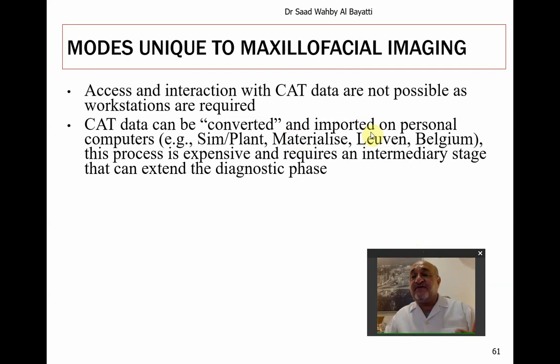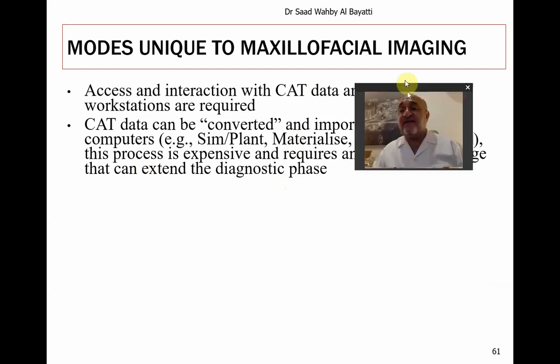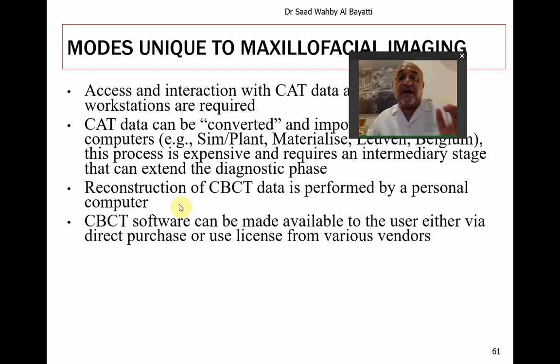It can be converted and imported on a personal computer like Simplant, Materialise, all these. This process is expensive and requires an intermediate stage and can extend the diagnostic phase. But the reconstruction of the CBCT is performed by a personal computer, any personal computer.